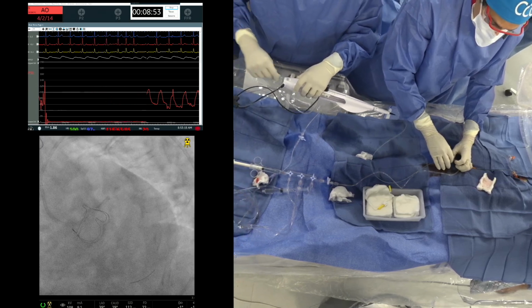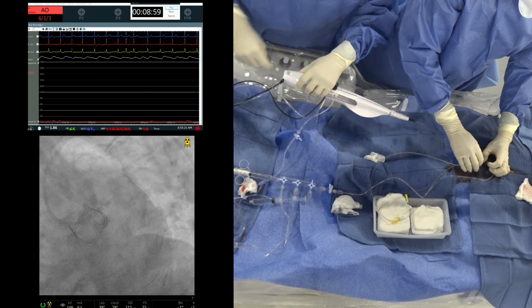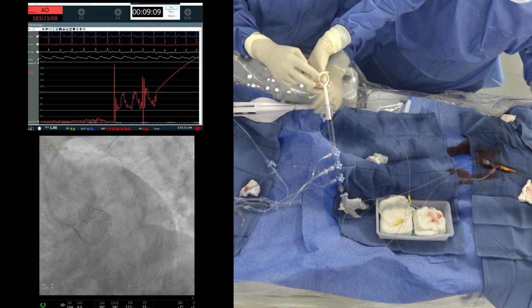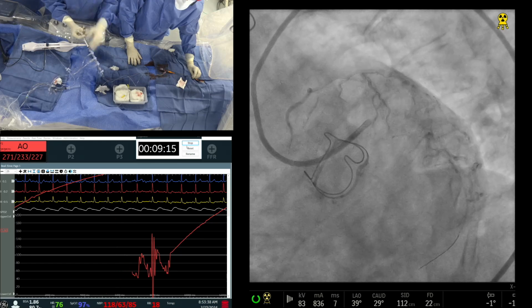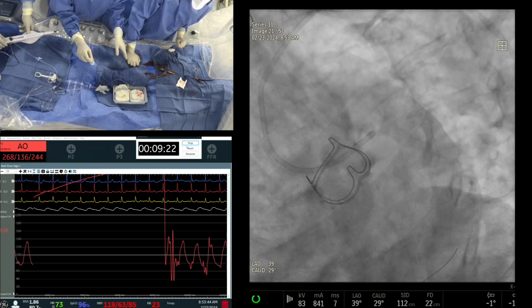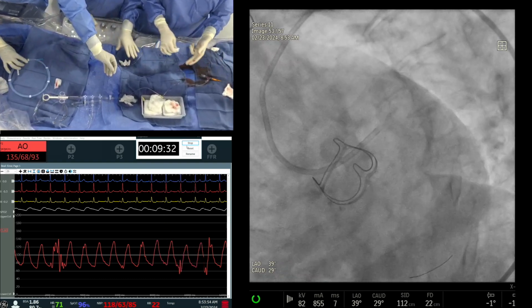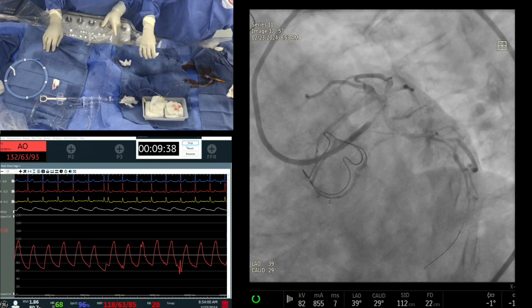Question now, what? Take a picture and then decide to go to the LAD. Okay, leave it. Let's take a picture. Good. All right. Ready to take a picture? There was a little more flush. But circ is okay. Yeah. But it looks all right. I mean, you can always decide, but the point is doing this here is not going to change our plan. I think we should keep only, no, wait 1 second. So maybe, same wire, we can get into the LAD now. How do you want to do it now?